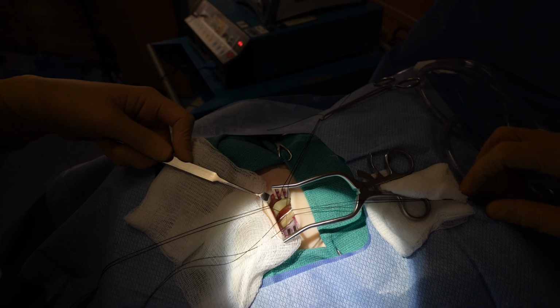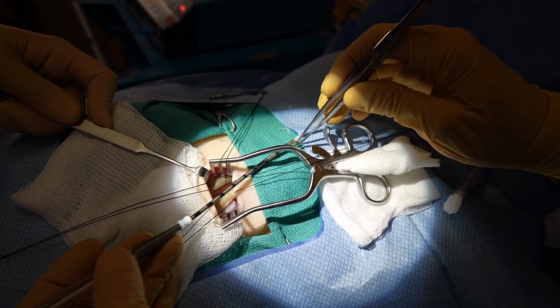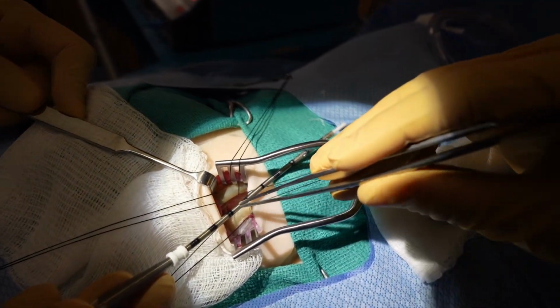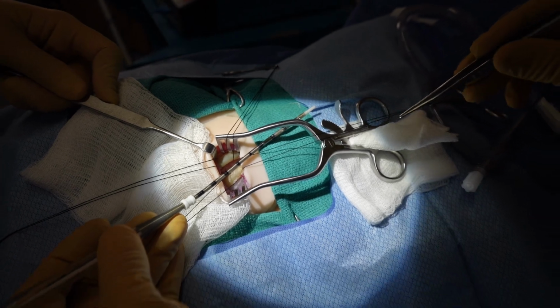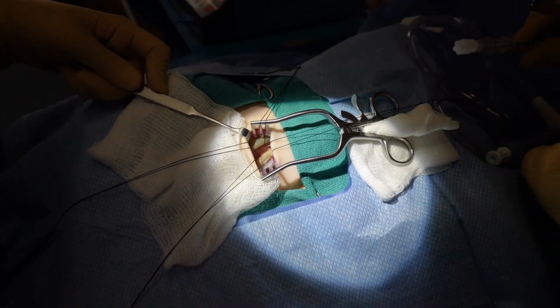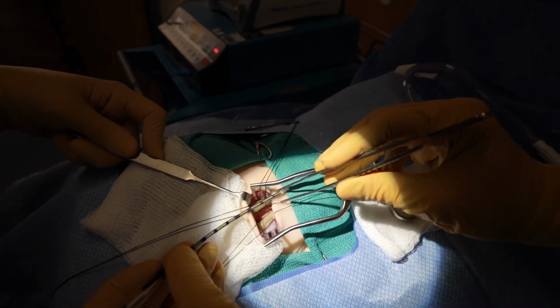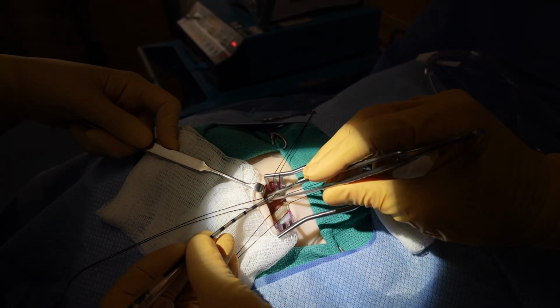We now obtain the venous cannula and note that the cannula should go into about 6 to 7 centimeters at the venotomy in a neonatal patient. I typically measure the vein tip down to the nipple just to the right of the sternum. The arterial cannula should go in about 2 to 3 centimeters at the arteriotomy in a neonatal patient. Next, we will cannulate the arterial side.